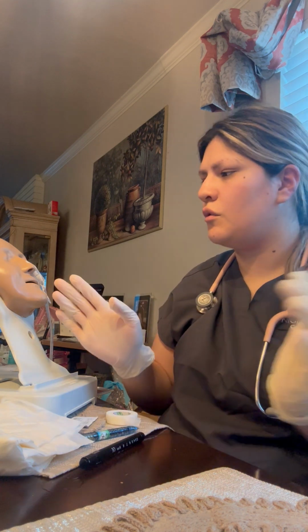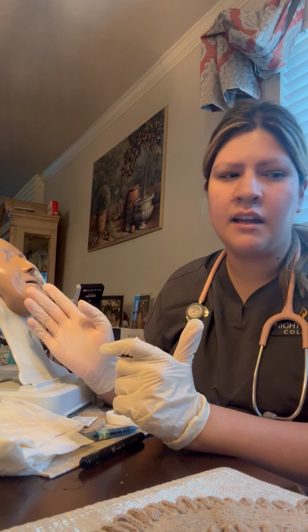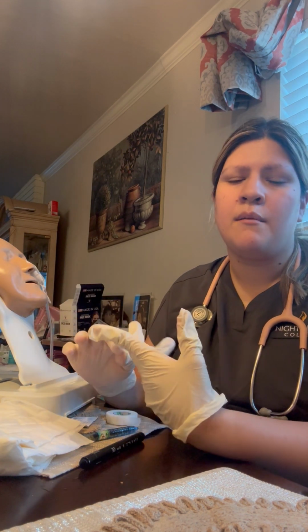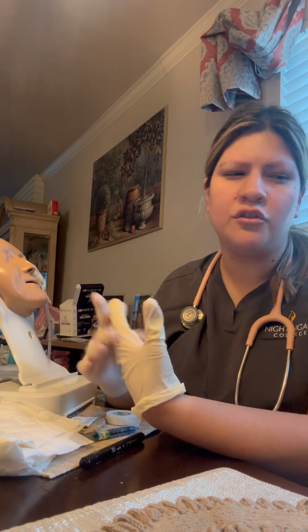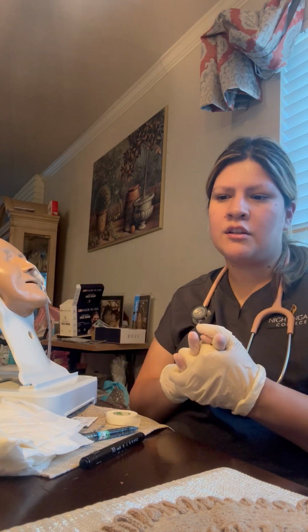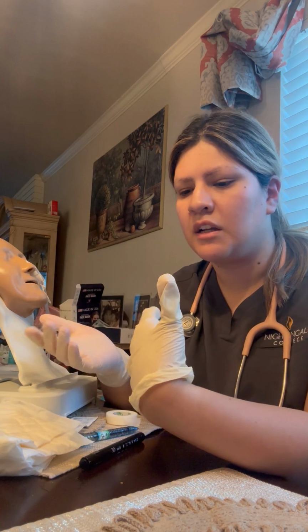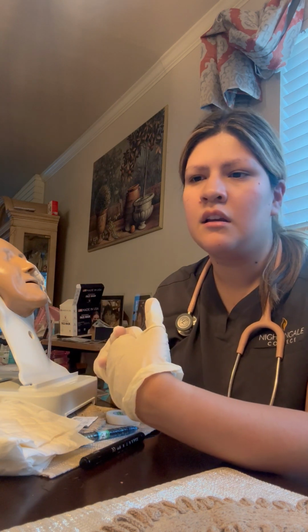You're going to maintain the patency of the lining, making sure that it's good, noting any characteristics, if there is to be any drainage, and then the amount of drainage. When you go to document, you're going to document the procedure, any care that was involved, how the patient responded, and any assessments that you did on the patient.